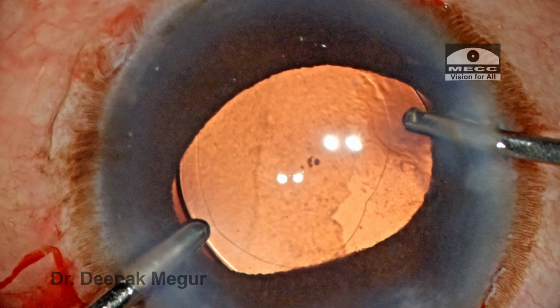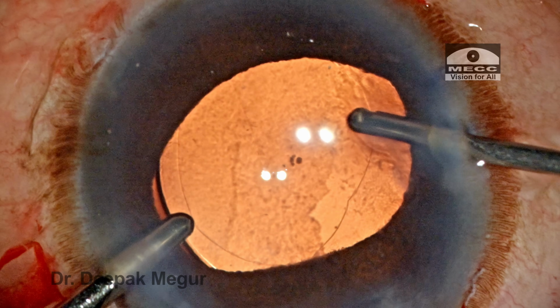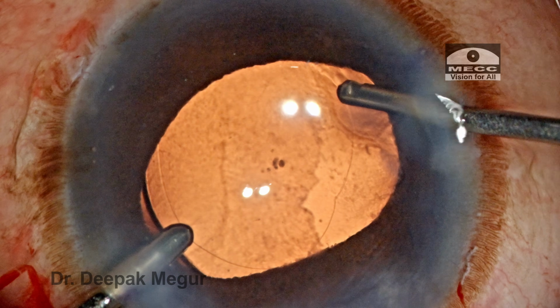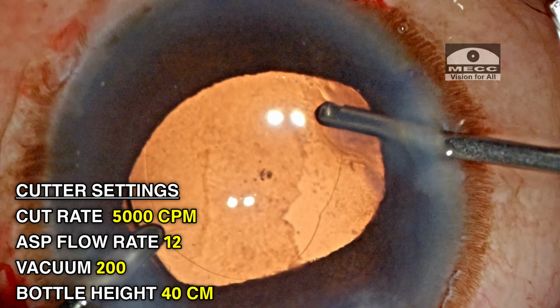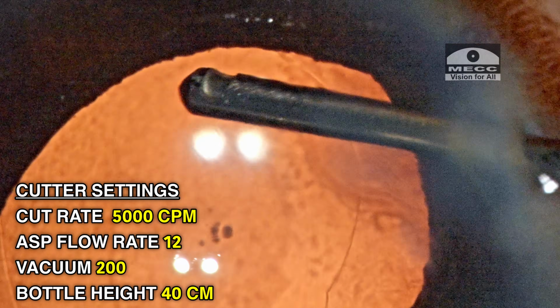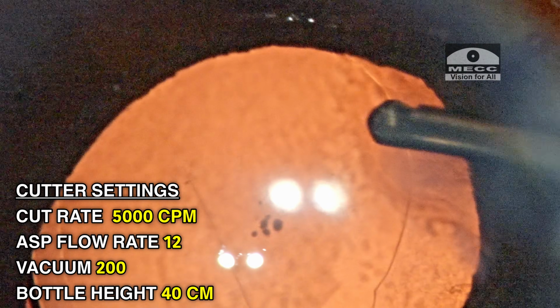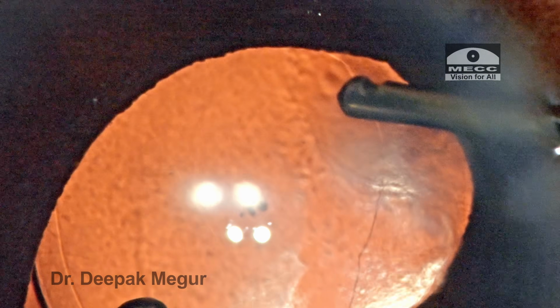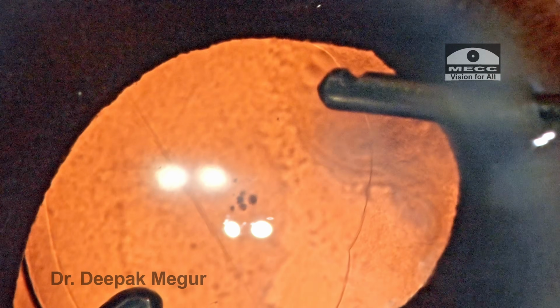The key to achieving success in such a situation, when you're working very close to the iris margin and the capsular margin, is to ensure that the flow rate and the vacuum are set very low. So in this case, the flow rate is set as just 12, the vacuum is 200, the cut rate is about 5000, and it's a linear mode. If you keep your flow rate low, it doesn't attract any tissue, so that you can cut without inadvertently chewing on to the iris or the capsule.